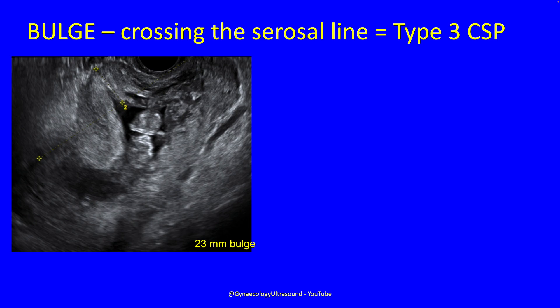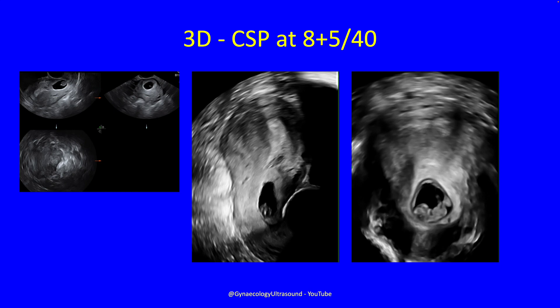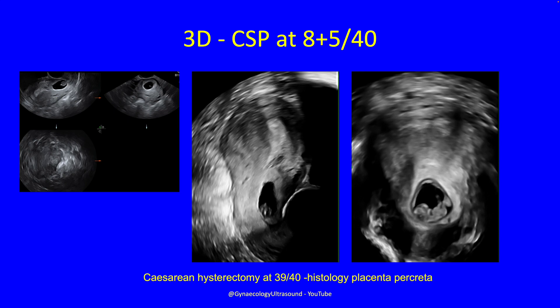Whether it's a type 3 scar pregnancy is really important. There's the serosal line — you can see this scar pregnancy is really bulging anteriorly toward the bladder. On 3D you can clearly see how that looks. You can do 3D to see what tissues are being involved, but it's not crucial. This patient had a caesarean hysterectomy at 39 weeks gestation and the histology was placenta percreta.